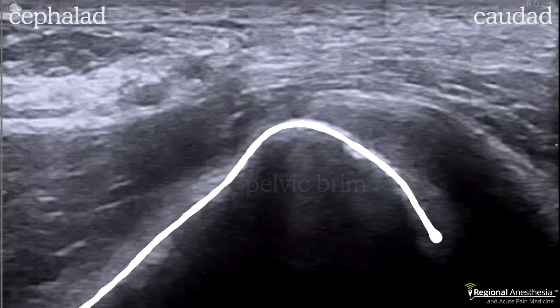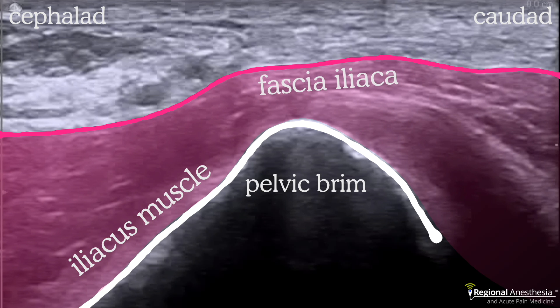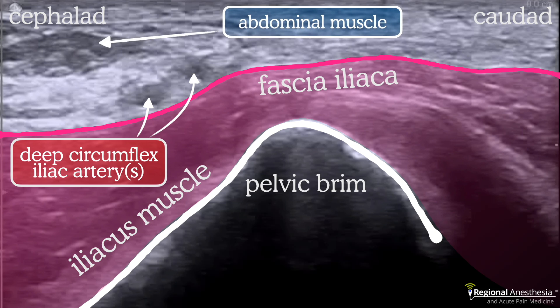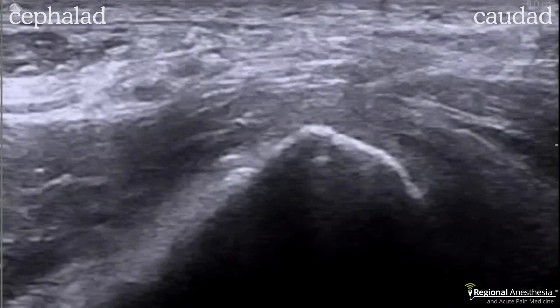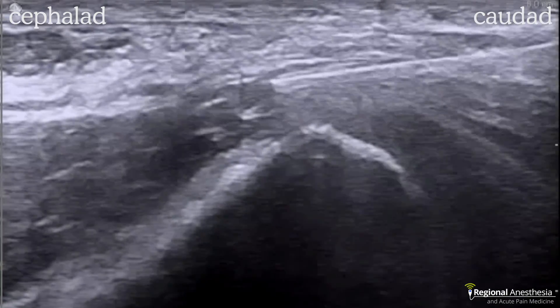On imaging, first identify and center the pelvic brim. The iliacus muscle can be seen coursing up and over the brim to enter the thigh, and the tough fascial sheet lining this is the fascia iliaca. Look for the circumflex artery — or in some cases two arteries — pulsating superficial to the fascia just above the brim. You should also see a slip of internal oblique muscle. The goal is to drive the needle to the underside of the fascia while staying on the pelvis side of the brim.